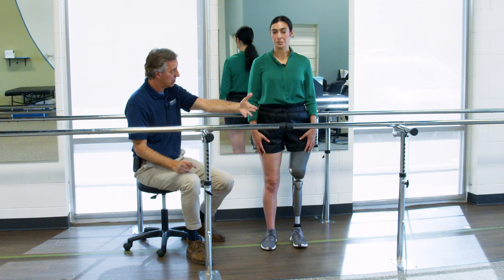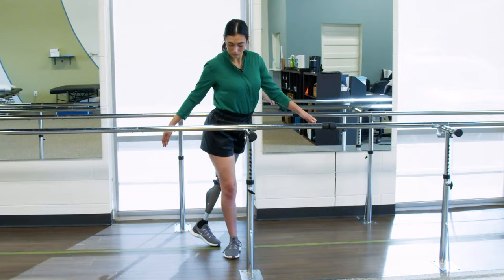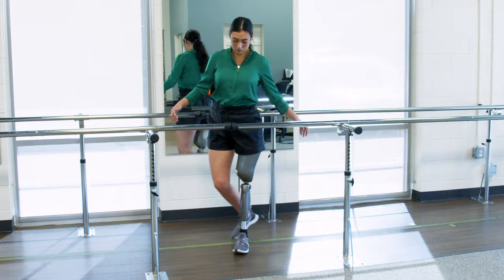And the third component, just like sidestepping, is speed. If Tracy says, I feel pretty good about that, then we just get out of the way a little bit and say, okay, Tracy, just go ahead and don't have to be real fast, but pick up the pace as you go and just think, okay, let me see if I step, put it on the ground and get going a little bit quicker. Good, same thing the other way. That's it, pick up that pace a little bit. There you go, step it out, cross over, step it out, cross over. Excellent, one more time coming back, pick up that pace, come right at me, boom, stick it on the ground, stick it in the ground.